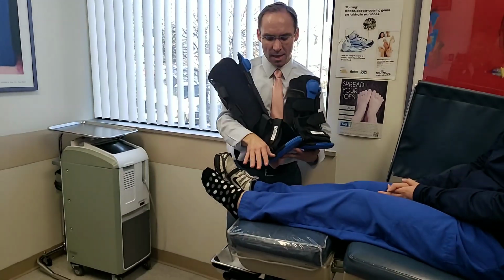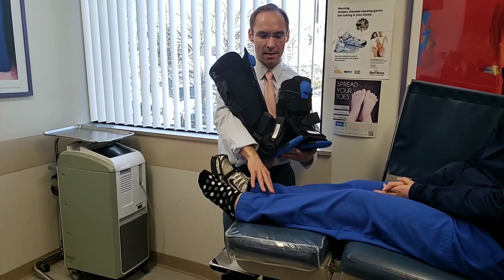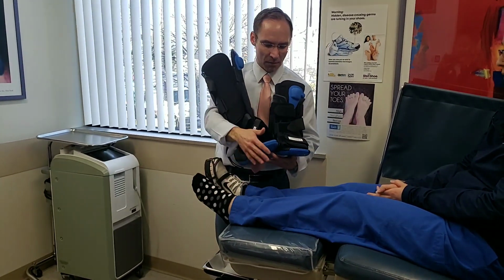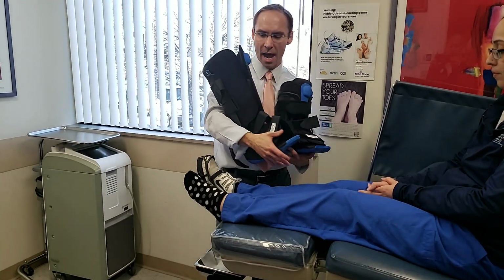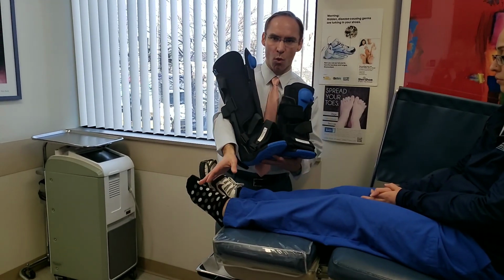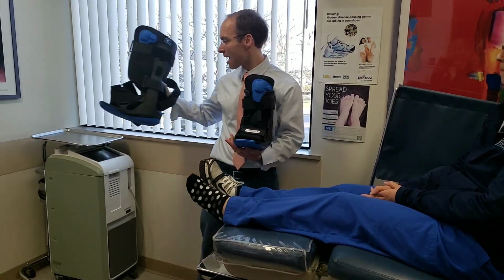If someone has a problem from the ankle up, like the Achilles tendon, the posterior tibial tendon, the peroneal tendon, it's not going to help if the boot only goes up to here. It's not going to give it the support. So you actually have to have a boot that goes higher, and that's this higher one. When it straps on, it takes more of the pressure off of the tendons. And I want to explain how to use these.